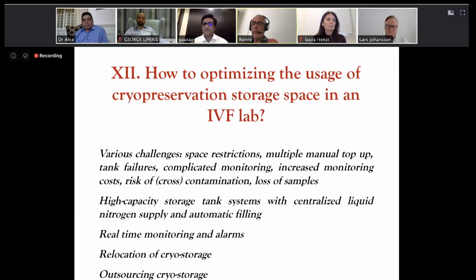Okay, excellent question. I came from a center that now does 5,500 up to 6,000 cycles, and we historically started cryopreservation or cryostorage in the classical Dewars. At a certain moment, you ran into the limitations of such a system. First of all, the space: you simply do not have enough space to put all these tanks.